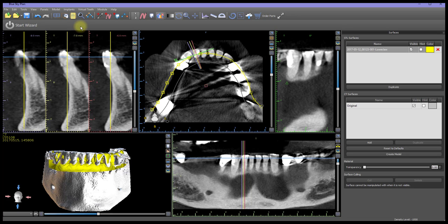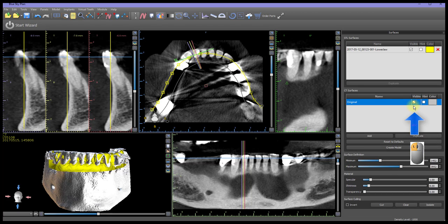In the Surfaces panel, left-click on the Visibility checkbox to uncheck all other surfaces except the relevant model, thereby hiding the other surfaces in the 3D view.